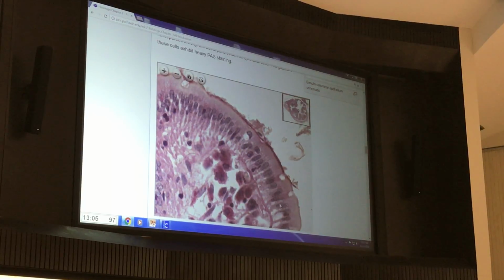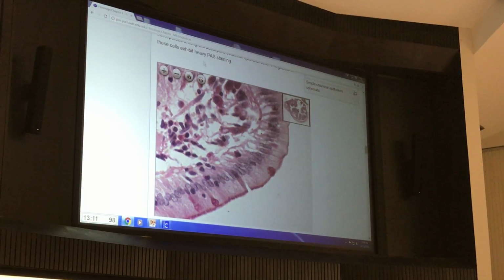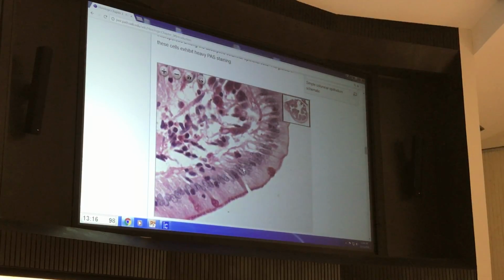You see that nice chain of nuclei? And in this case, it's also PAS staining, so a lot of them won't be stained. Why are most slides always going to have that hematoxylin stain? What is hematoxylin? It's that basic stain that stains acidic. So why are we always going to use hematoxylin? Because it really highlights the nucleus. That's why it might say PASH. So it's PAS, and we're looking at the carbs, but the H is a hematoxylin. And it's just a way of saying, here's the nucleus and orient ourselves.